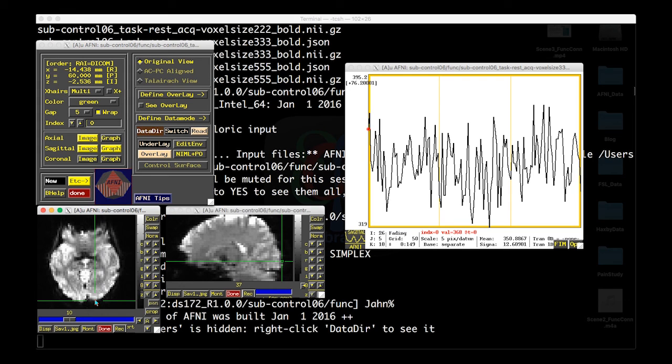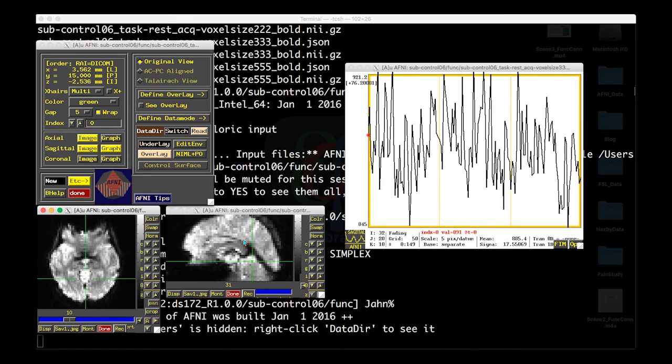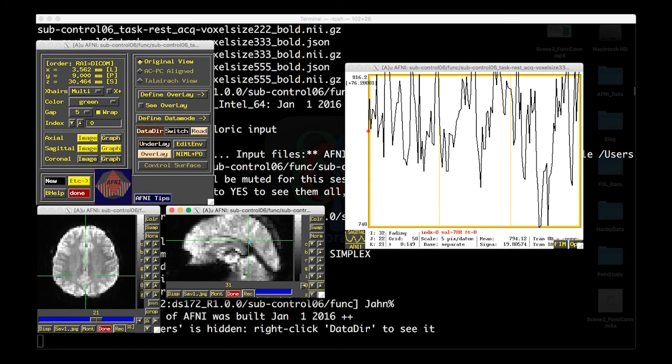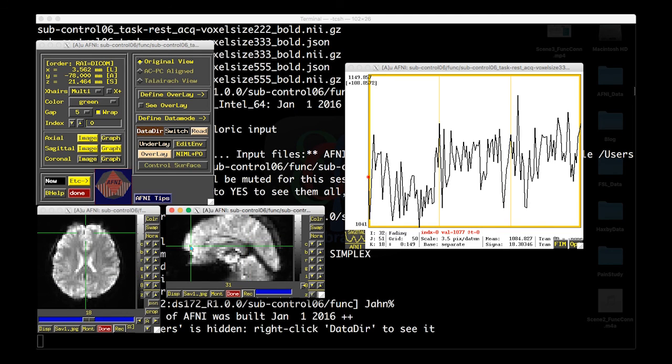So we're going to be doing the same thing, but looking for the default mode network. What that means is that in these functional images, once we pre-process them and clean them up, we'll be looking at the time series of the posterior cingulate cortex and seeing how well that matches up with the time series of the anterior medial prefrontal cortex.